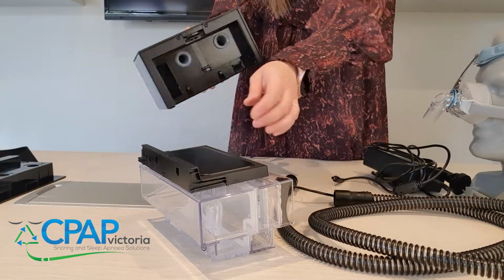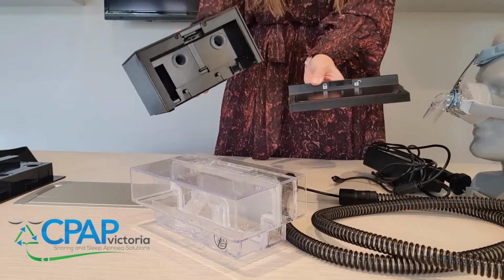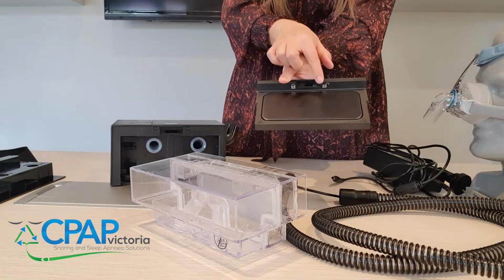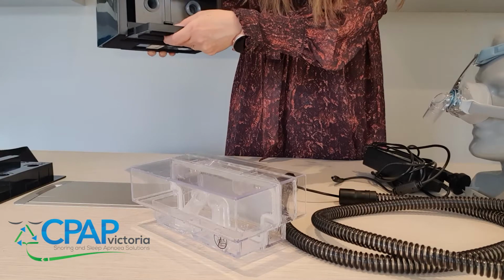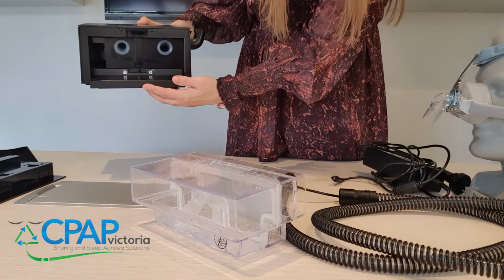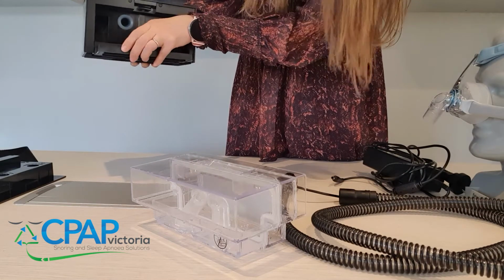Next, we'll show you how to insert the heated plate into the device, making sure that beforehand you have it in the unlock position. Slide it in firmly, make sure it connects all the way to the back, and then slide that back over to the locked position so that it cannot move out of place.